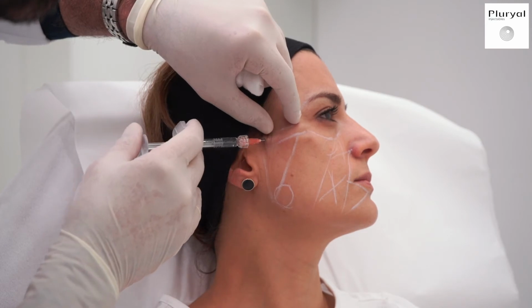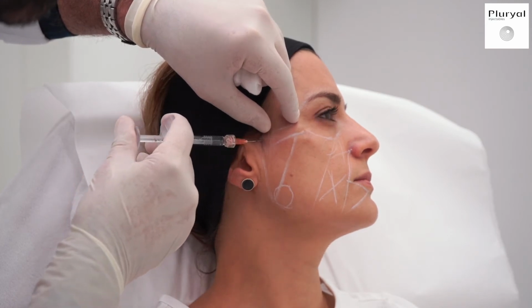I try here also to go to the lateral sulcus.